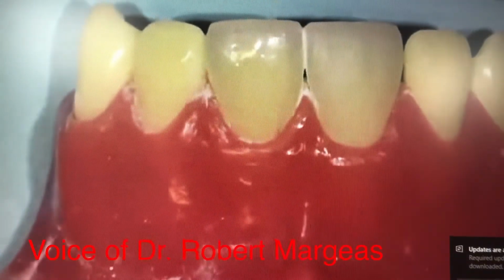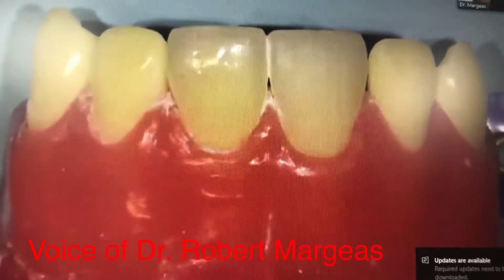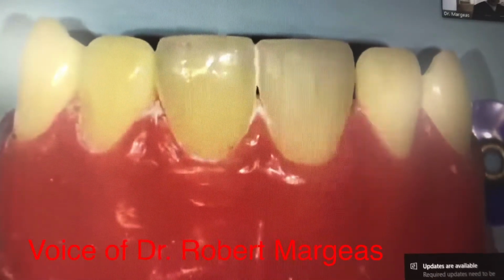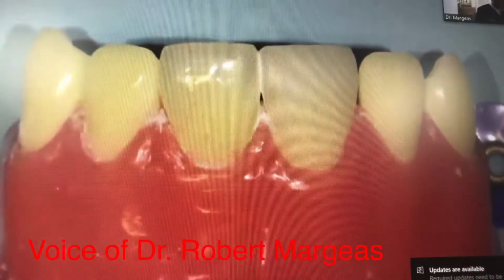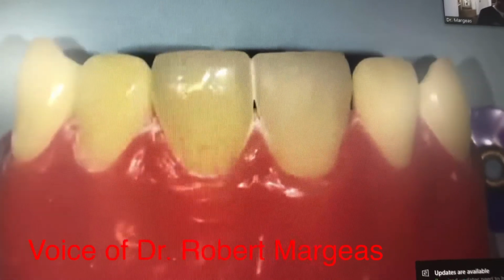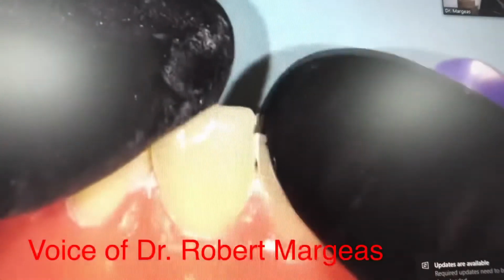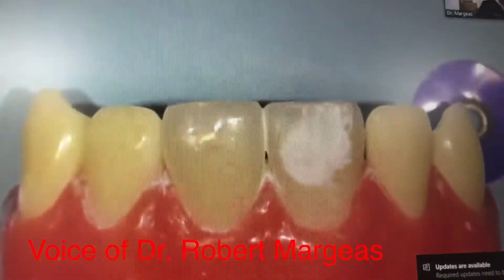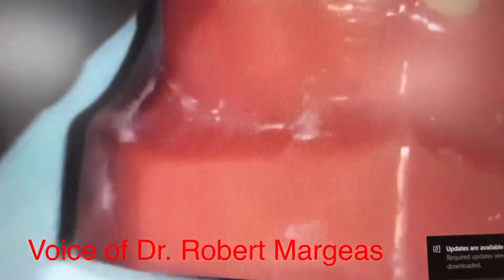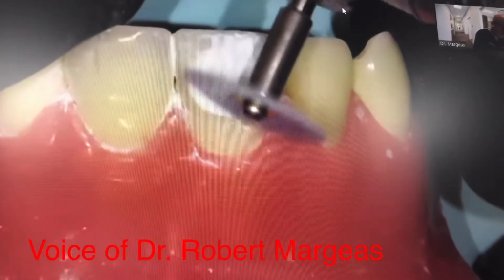the perikymata. And the last thing that I'll do is I'll take my enamelize on a flexi buff. Watch the shine now, and then you'll be able to see this shine on the tooth. So I come here, my tooth like this. Turn the speed up a little bit. Watch how you're going to see a nice shine here. This is a flexi buff from Cosmodent.